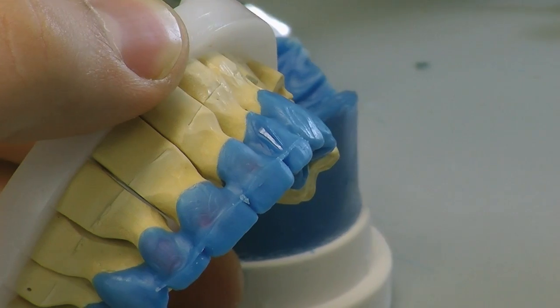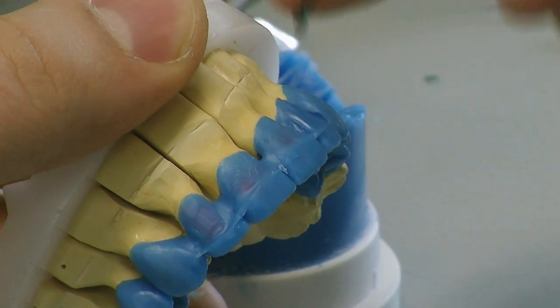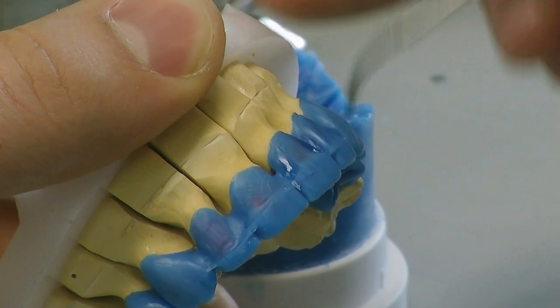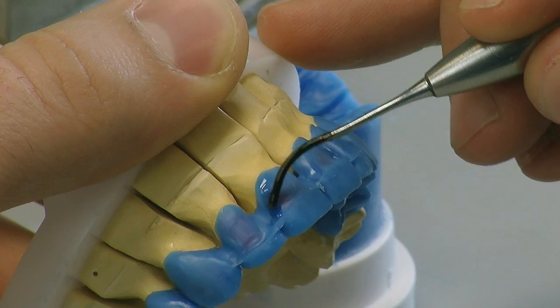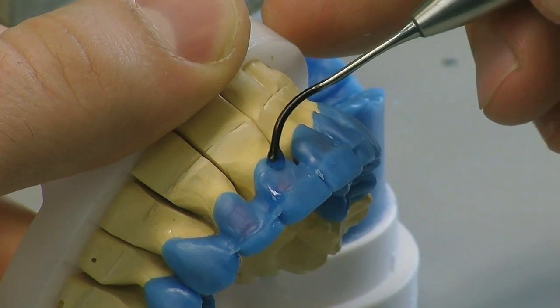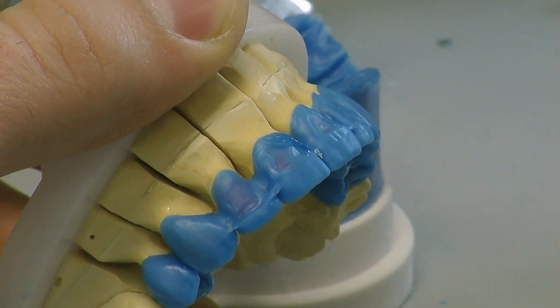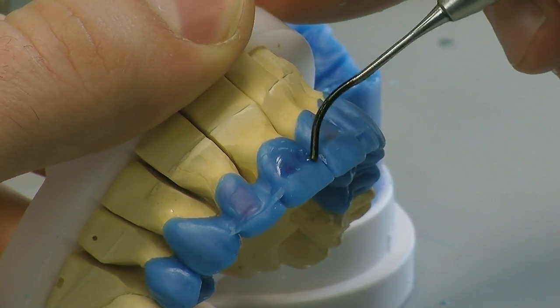Basically what we're going to do now is fill in the mesio and distal line angles. So we're connecting our substructure wax up with our incisal edge addition, and we're going to be filling in all the margins. We're now constructing full contour our anterior section, our 2-to-2. So it's just a wax additive technique. It's very good, very accurate. It's always good to take your time on these things. Never rush them. The more accurate you are, the better fit you get.